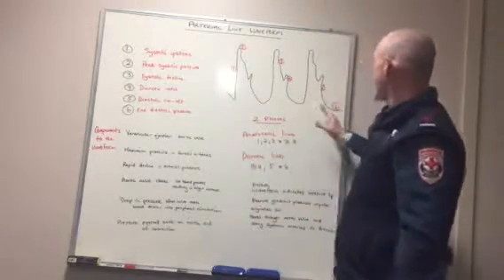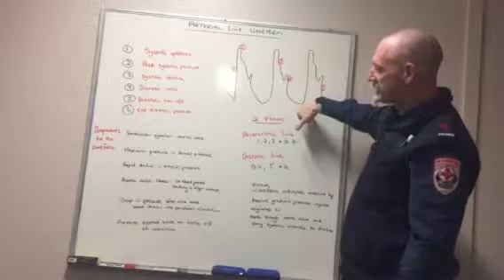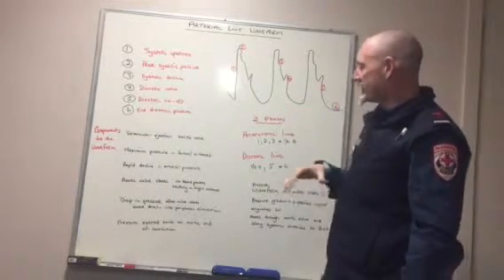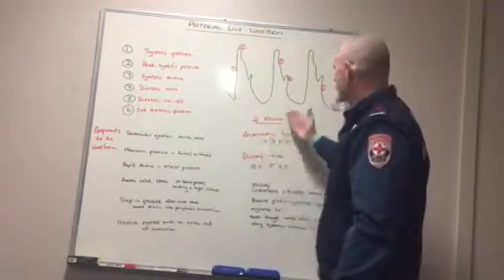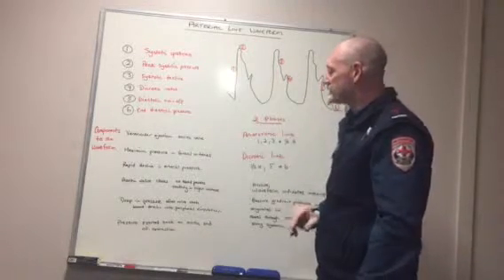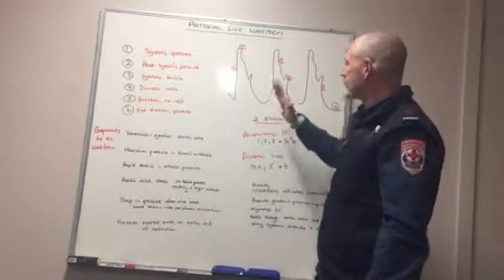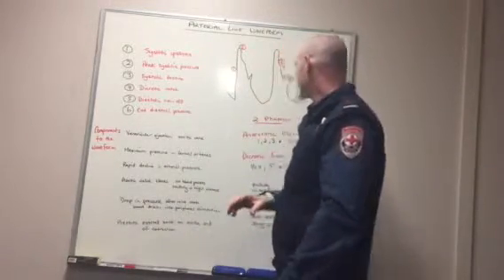And then finally, the end diastolic pressure at the bottom of the curve here is the pressure exerted back onto the aorta at the end of the contraction, and then we start back up again into our systolic upstroke again. So that is the main components of what an actual waveform is.